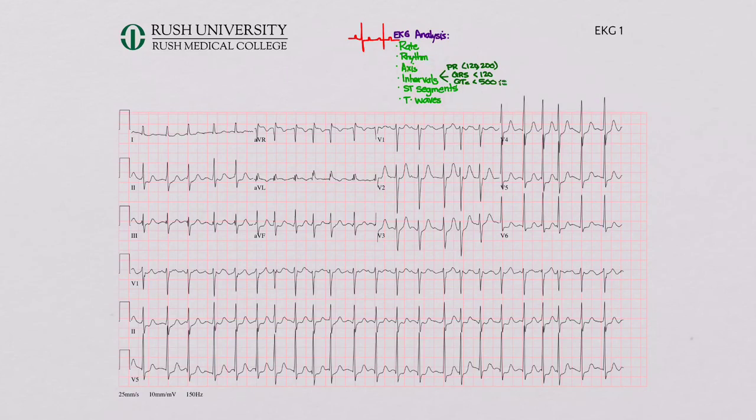So let's get started with EKG number one. You should have gone through all these, at least make an attempt at them before watching these videos. For the rate, we have 23 beats on this 10-second rhythm strip, and since we're going for a minute, 23 times 6 is 138. So we've got a tachycardia.